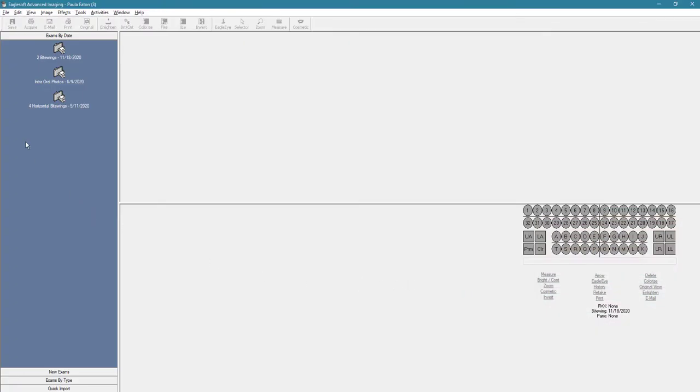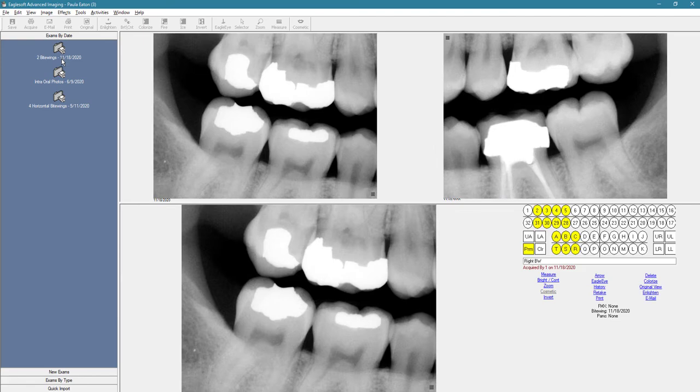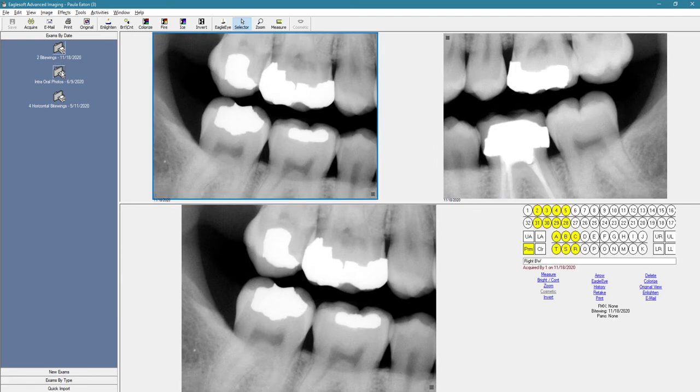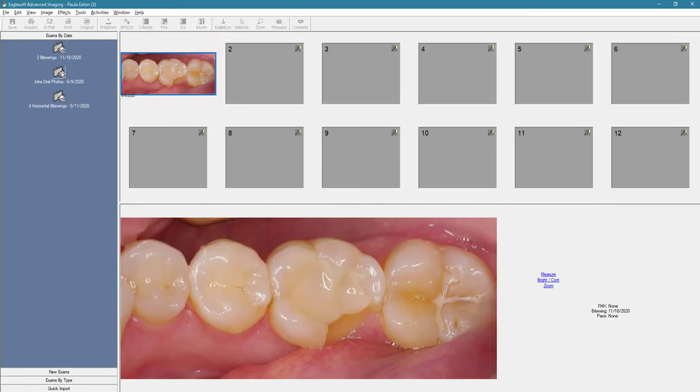In here, it's going to default to this exams by date, and basically each exam is going to be listed on its own by its date.